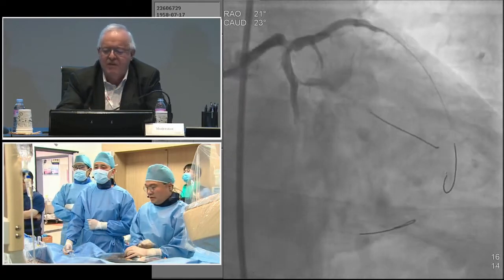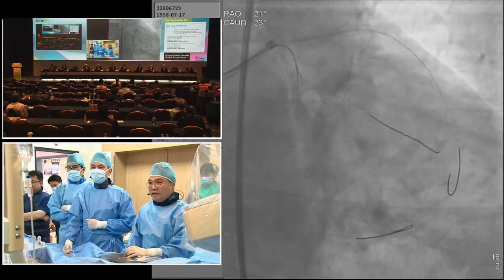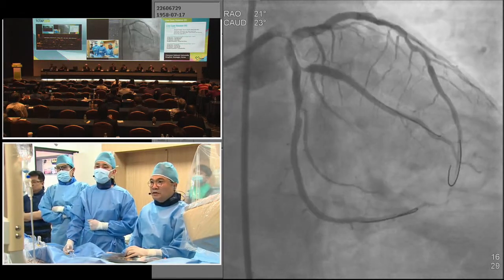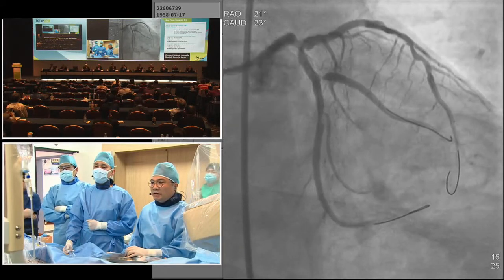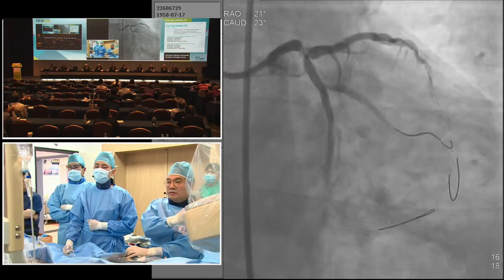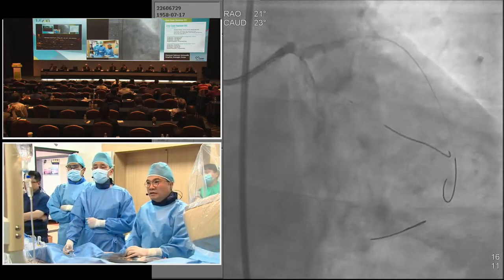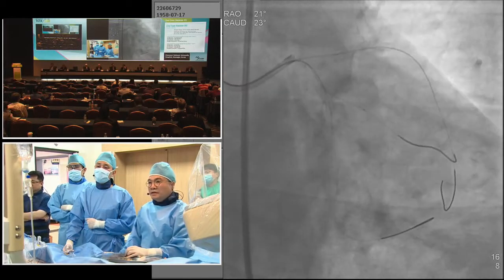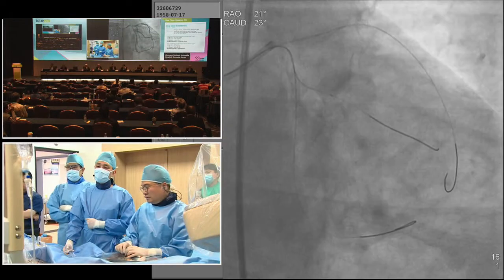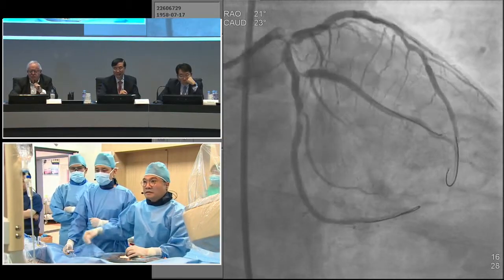Sorry. Okay, so maybe after the stenting in the circumflex os, and then left main to LAD, we can think about the obtuse marginal branch later. Carina shift usually is functionally not significant, so maybe we can wait. Okay, I think you have to test it. This is a very tight lesion with some reduction in flow.